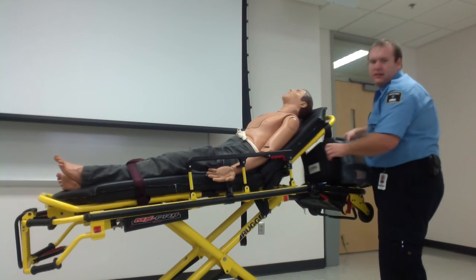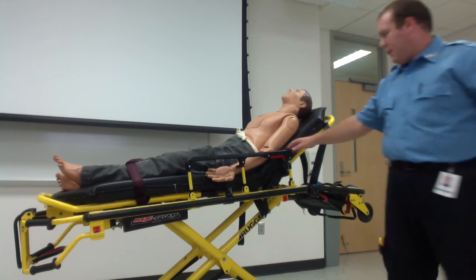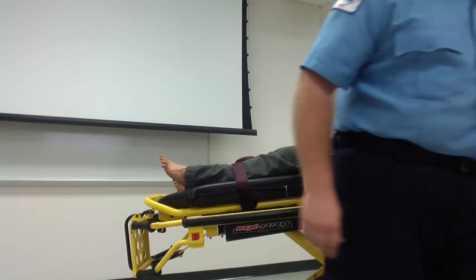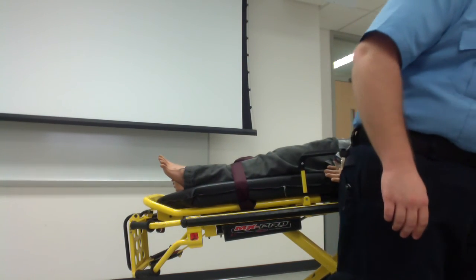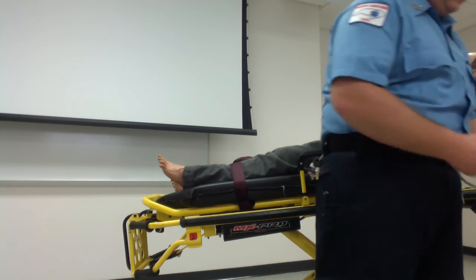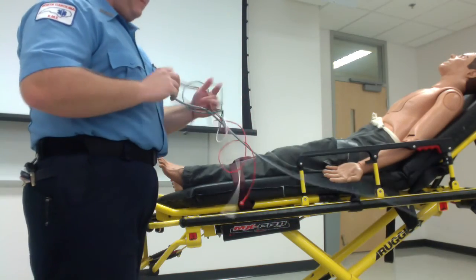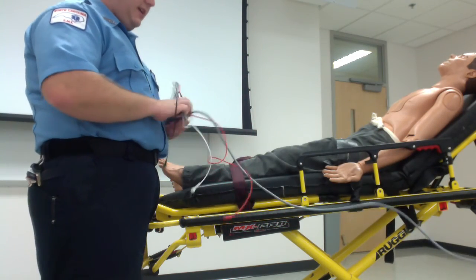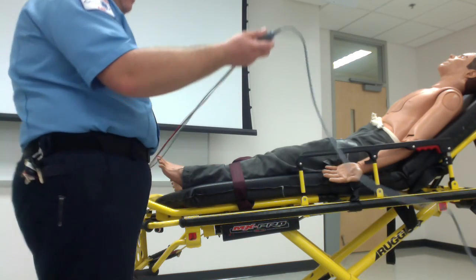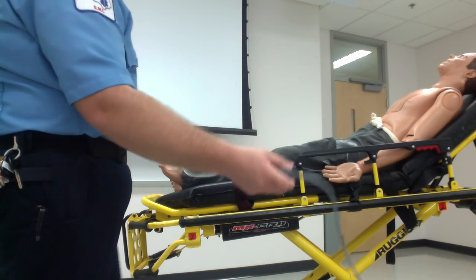So, let's set this up here. First off, like I mentioned earlier, the first wires you put on your patient, once you're saying you're going to run an EKG, are going to be your limb leads. Whenever you pull these out of your monitor bag, however it's set up, they will more than likely be tangled up.